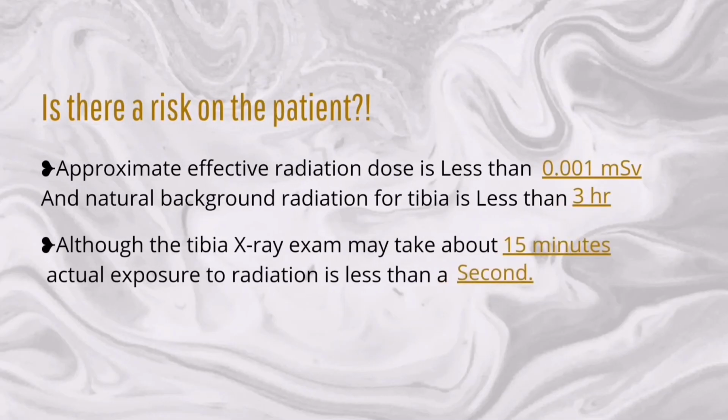The question that patients often ask when they have an X-ray examination: is there a risk to me? Is that harmful? If you ask especially about tibia examination, simply I will answer no, it's not. Okay, but why are you so confident?